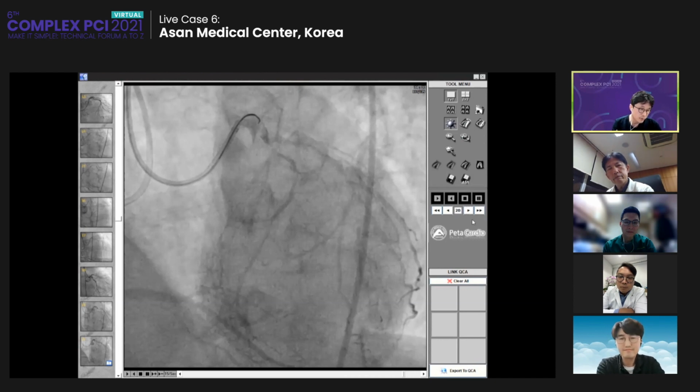And the second one is they tried it with a polymer-coated tapered wire. But for using a second wire for the parallel wire technique, it is wise to use a more controllable wire to access the point that you want. So all the methods for the beginning and using some CTO techniques were wrong, but I'm not sure. So my strategy was to go to the antegrade first procedure and do it the same way as they did again, but with lots of information and some thoughtful methods.